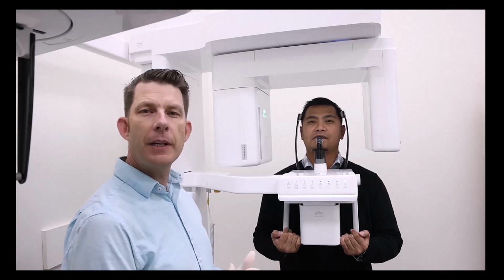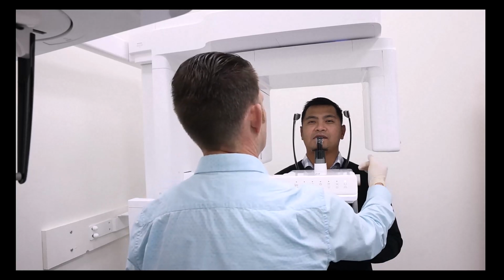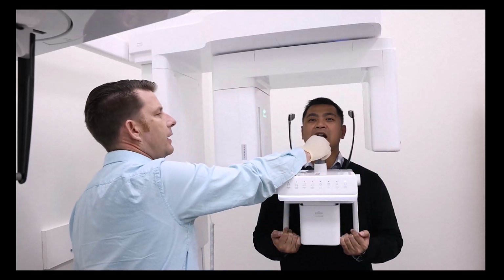The scan is now complete. I'm going to go ahead and release the patient from the machine. You can go ahead and take a step back.